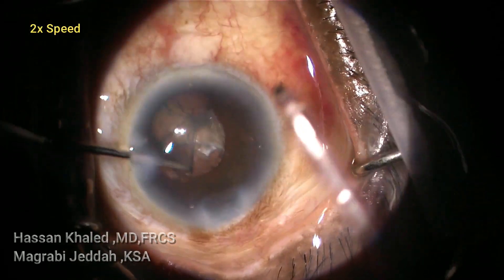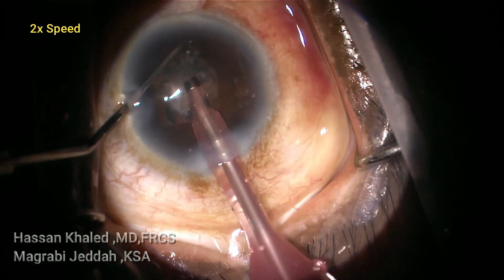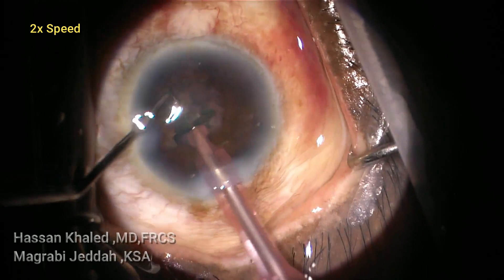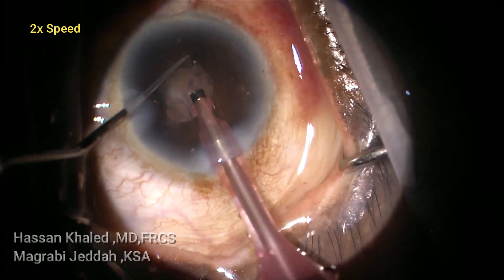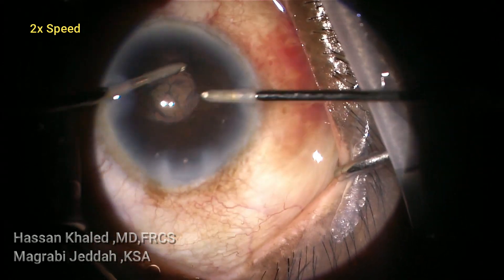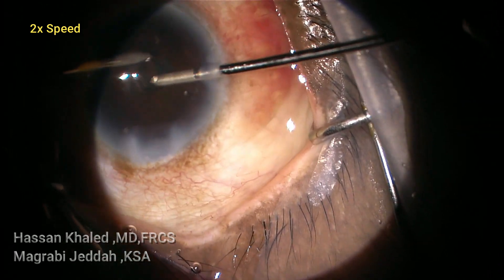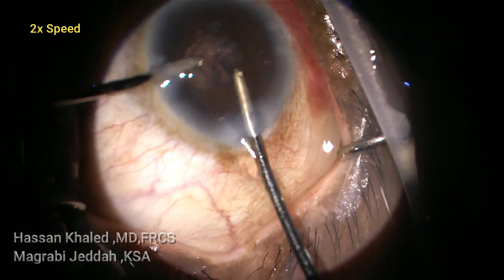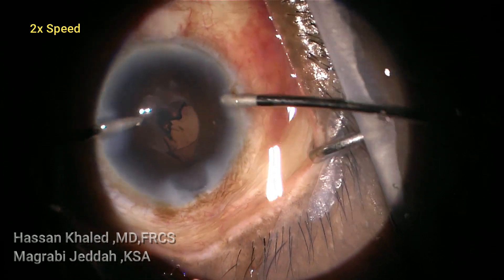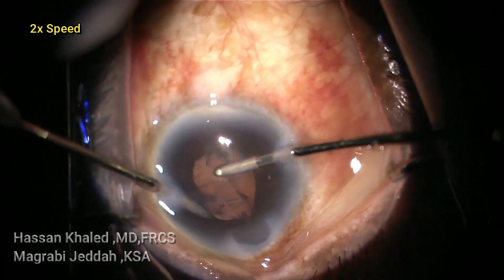Again injecting dispersive OVD and rotating this shell. Doing only aspiration for the epinucleus and cortical shell. Now going to remove the cortex using bimanual irrigation-aspiration. You can see the pupil is still small, and the cortex was stuck to the posterior capsule, so I'm trying to push the iris with the irrigation probe, then holding the cortex, peeling it, and aspirating it.